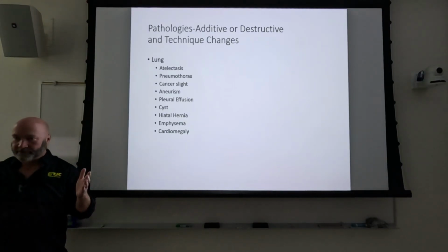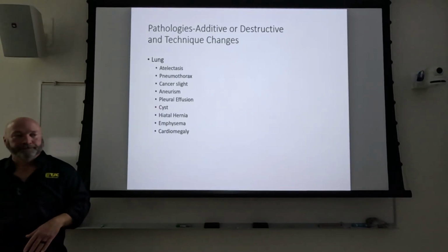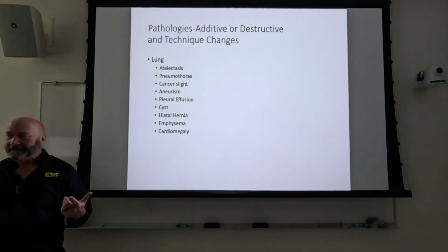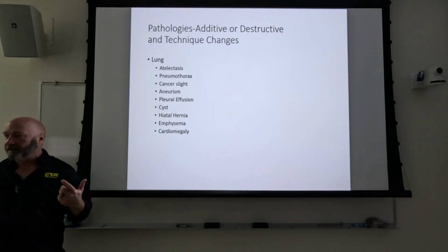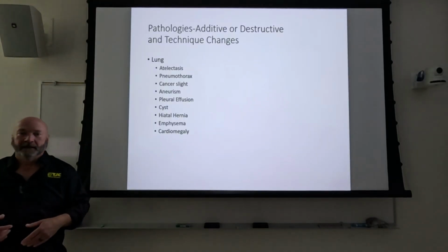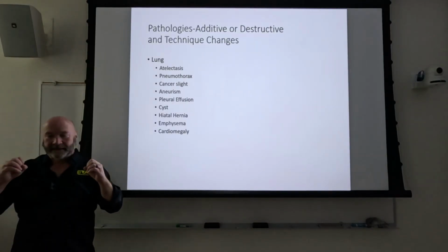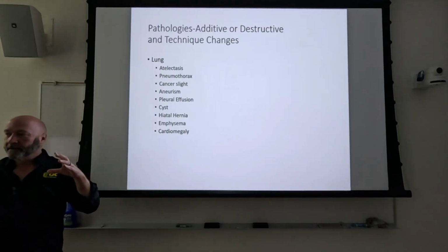rectangular shaped image receptor and providing the patient's not hypersthenic, you might consider going lengthwise, because with emphysema, we see the patient, they're on oxygen and they're wheezing, you immediately think the patient can't breathe in. You know, they're having a hard time getting air in. When in fact, what happens with emphysema is those alveolar sacs lose their elasticity and they're stuck open, okay?